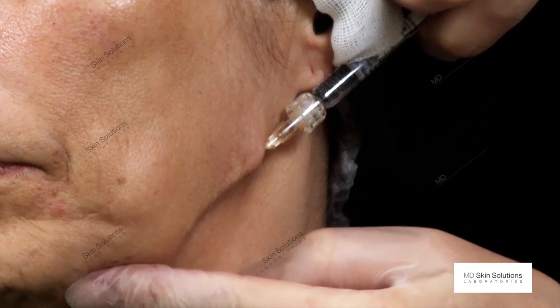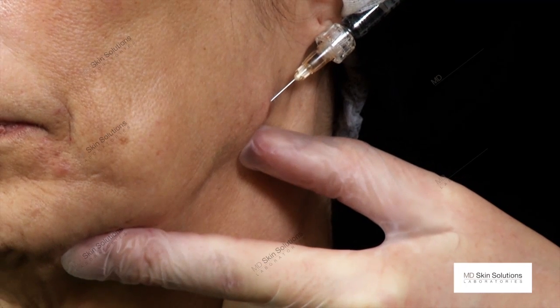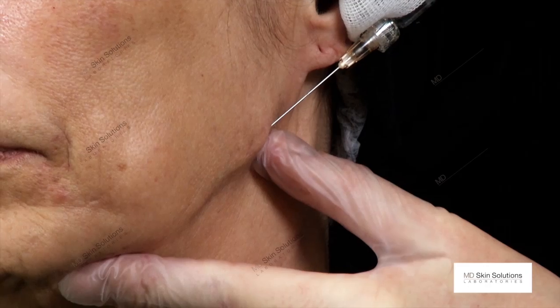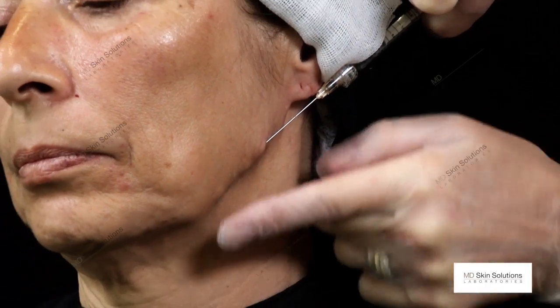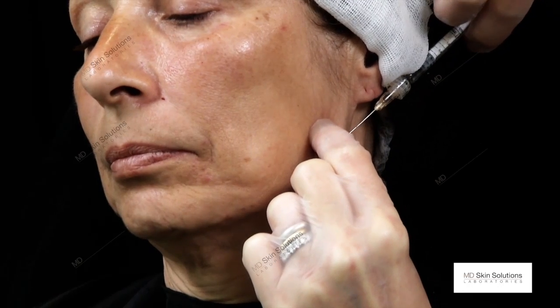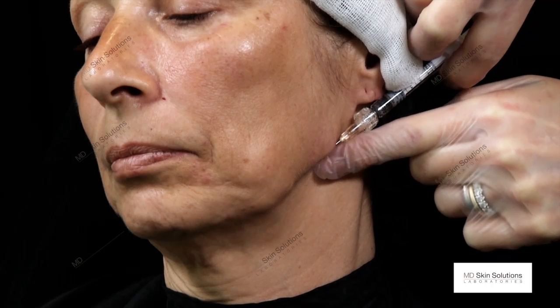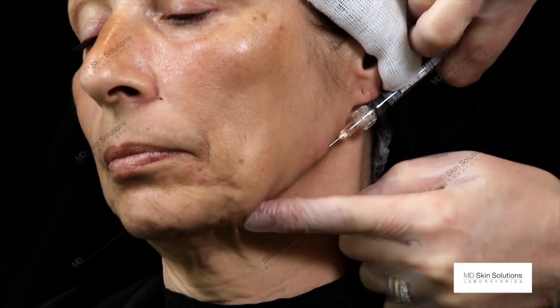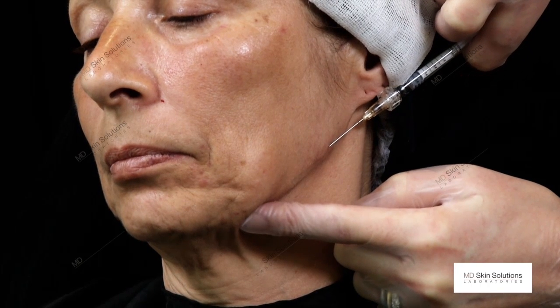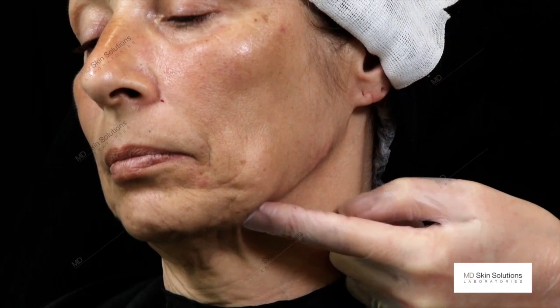And now I place the filler on the bone in a retrograde fashion again. Second pass, again, objective is to redefine the jawline here. Stretch the skin and see how the filler works in perfectly.